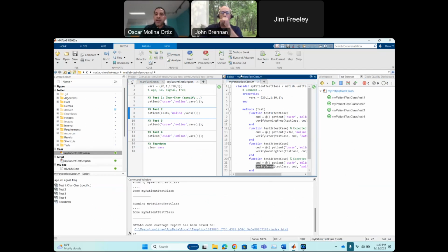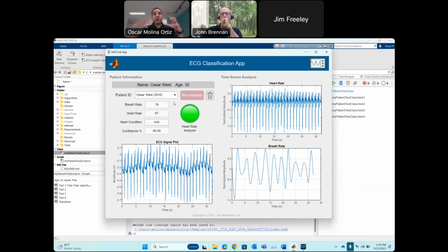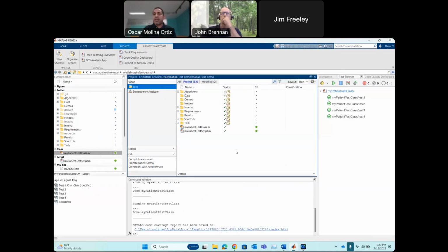Now, imagine having to do this with each one of your unit tests in your software units in your program. So for example, right here, I would have to do this manually with every single piece of my software. So this can become cumbersome very quickly, right? So the question there is, can we do better than this, right? How can we put all of these tests together in one place that I can manage at once, and be aware of which tests are failing, which tests are passing, and get the code coverage report, not just for one single test, but for the entire test suite.